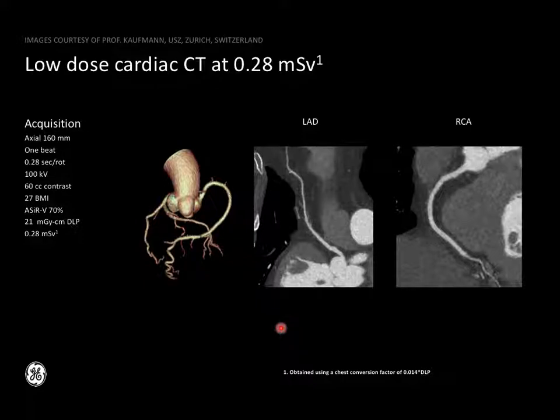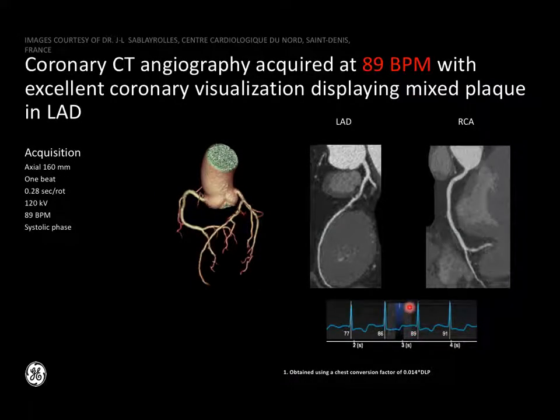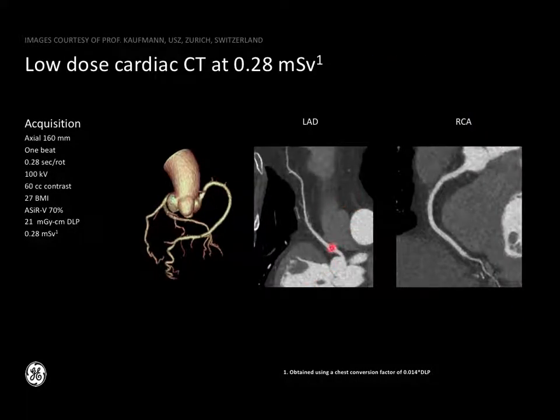And the other fantastic thing is that if you know when you're going to shoot your image, and we'll say we're just going to take one picture at end systole, then we only need to have the x-rays on for a very short period of time, say 150 to 200 milliseconds, right? And at that point, you can make these pictures of coronary vessels using a remarkably low dose, i.e. very few photons get used to make this picture because it's taken over a short period of time.